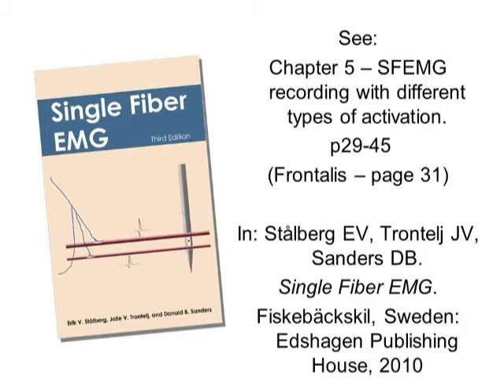Detailed information about making single fiber EMG recordings with different types of activation can be found in Chapter 5 of the Single Fiber EMG monograph. Information about recordings in the frontalis are on page 31 of that chapter.